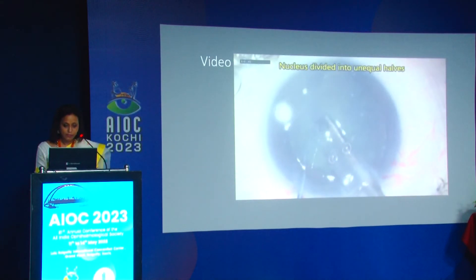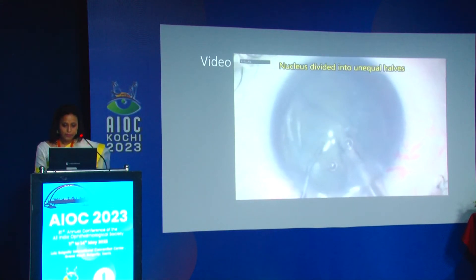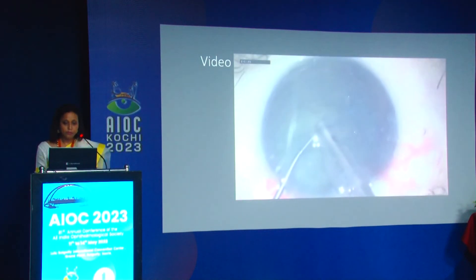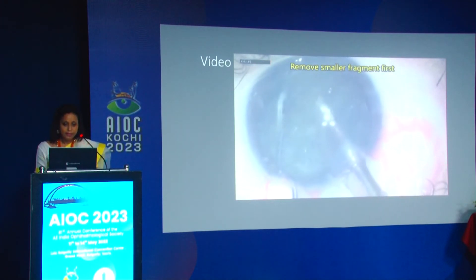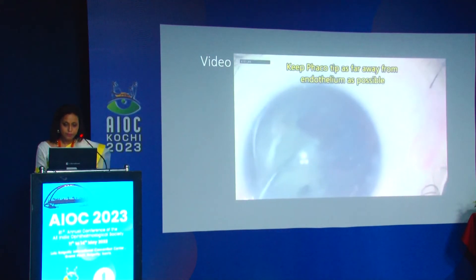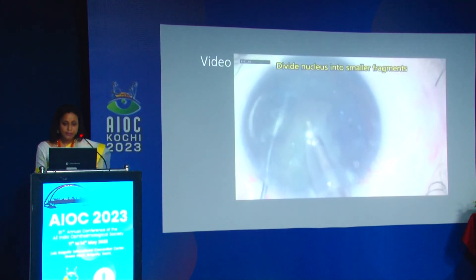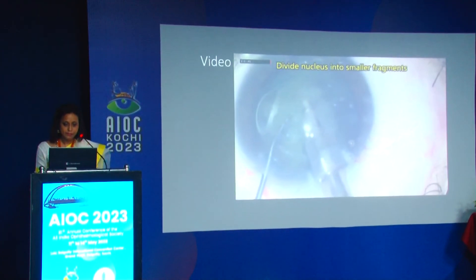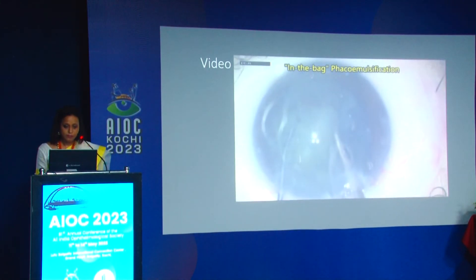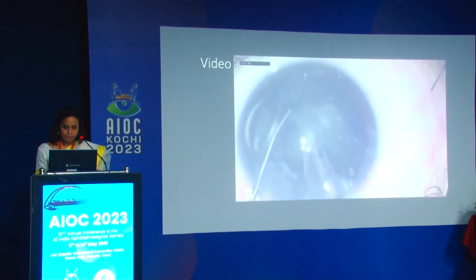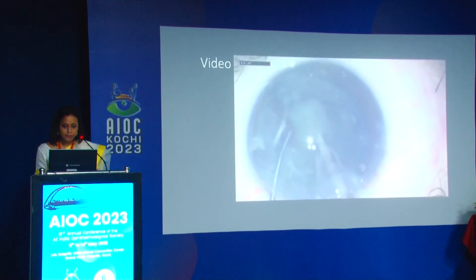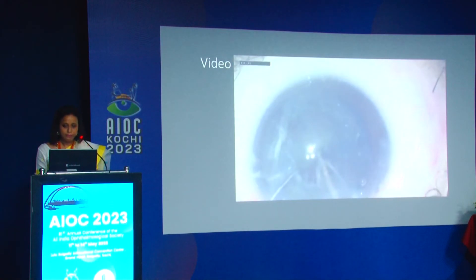Unfortunately my trench is not very centered, so the divide is about two-thirds to one-third, but I continue. It is important to repeatedly inject both viscoelastics. Remove the smaller fragment first, keep the phaco tip as far from the endothelium as possible, and divide the nucleus into smaller fragments — larger fragments have a higher chance of hitting the endothelium. In-the-bag phaco emulsification should be performed as much as possible, avoiding nucleus pieces striking the endothelium.